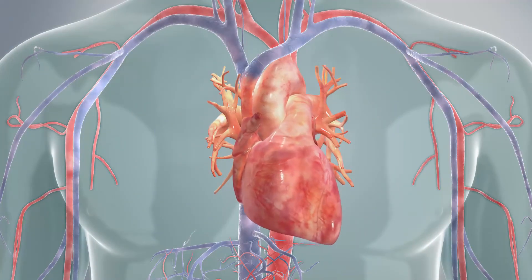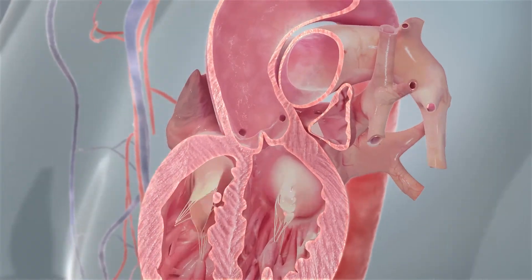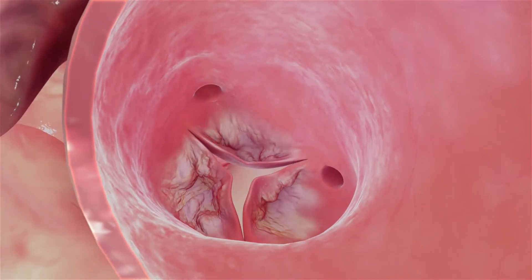This is an animation of what we do during the TAVI valve procedure. You can see the aortic valve there flapping as the blood passes through, and this is what it looks like when it's hardened and calcified and what we call stenosed.